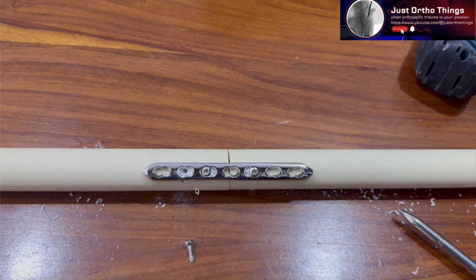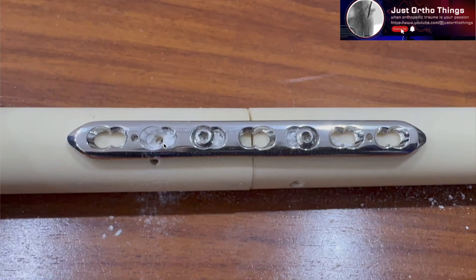Removing the screw shows how the drill hole has migrated. Earlier the hole was drilled close to the metallic edge, but after tightening, the hole has migrated away from the metallic edge — meaning the plate itself has migrated away from where we drilled, because the compression screws pull the plate towards the fracture site. This neutral screw pulls the plate towards this fragment as the eccentric screws are tightened. The second screw tightening brings the first screw hole back towards the neutral position, gaining an extra 1 millimeter of compression.